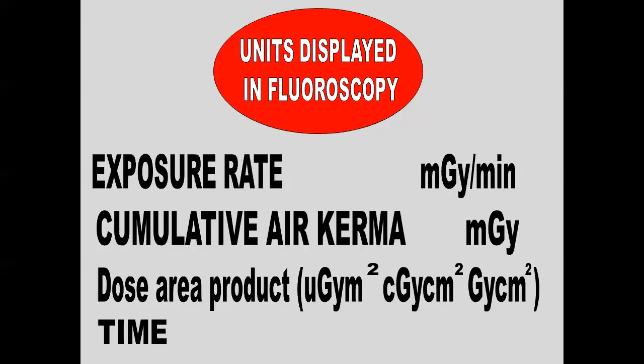What about using fluoro versus cine? Huge difference. Fluoroscopy rates are capped at about 110 milligray per minute. Cine is unlimited. It's whatever the machine can put out. So even on a large patient, if you're doing 100 milligray per minute and then you step on cine, it's going to be somewhere between 600 to 1,000 milligray per minute. It is a 10, 20-fold, even sometimes 100 times fold increase in the radiation dose that you're giving, the exposure rate.